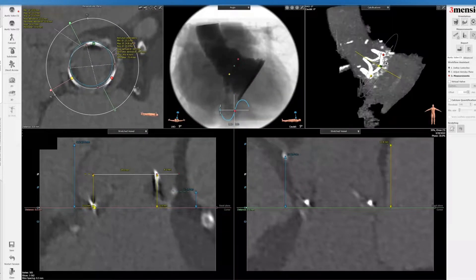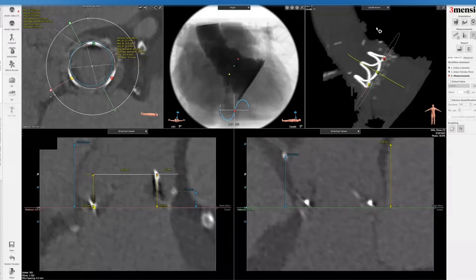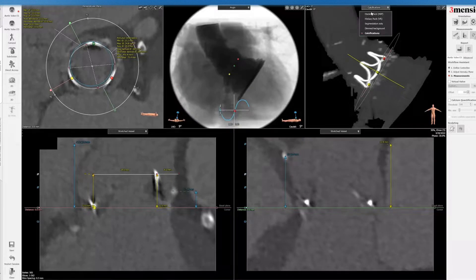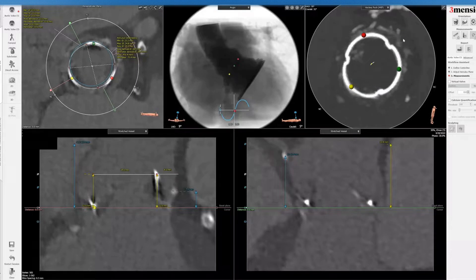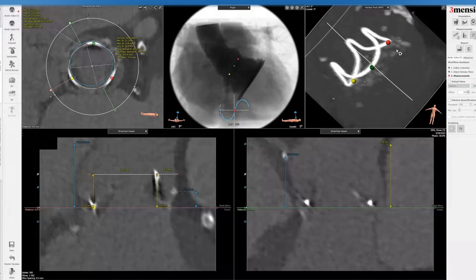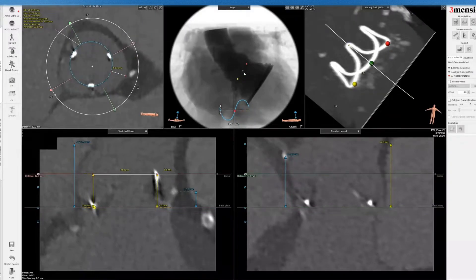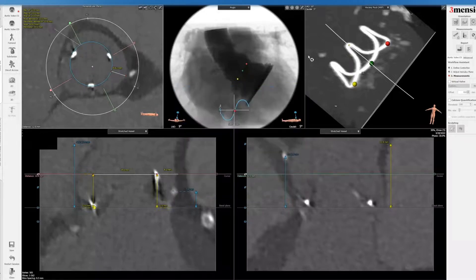You can see on the view how this is a Paramount 2700 — it's just a metal frame, that's why it's not fracturable. I'm going to do the ascending aorta measurement, then go into a view like this using the hockey puck and note the calcification. I'm going to save this VTC to the left main just for illustration purposes — remember this distance is so large that it's really not clinically relevant.